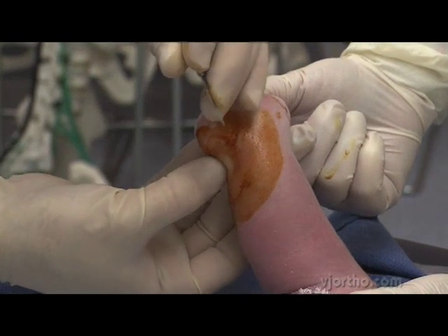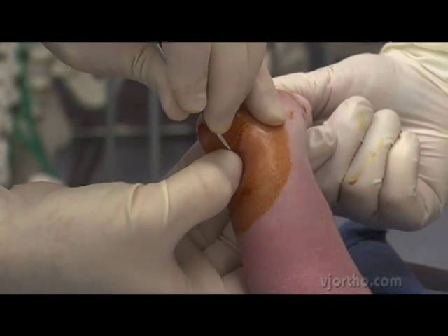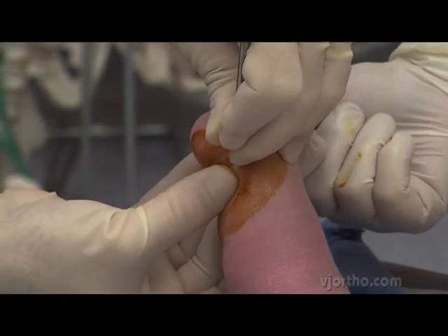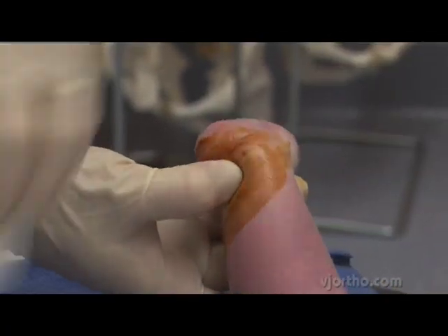I will palpate the tendon where I need it, a centimeter proximal to the heel cord insertion. My blade is going to enter from medial to lateral, and then cut from front to back. And that's the pop — you can see that move. That was the tendon being released.